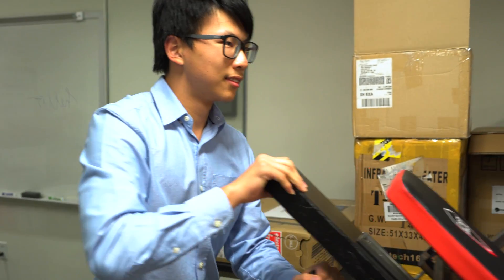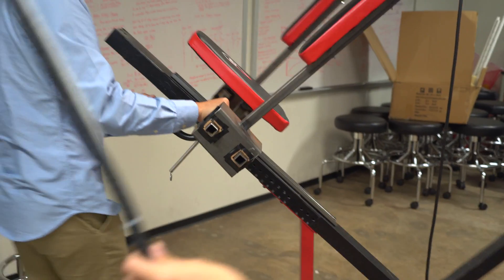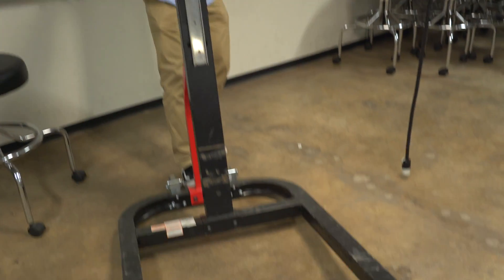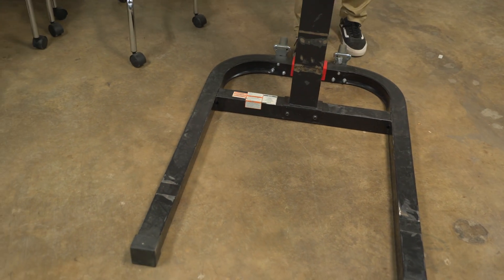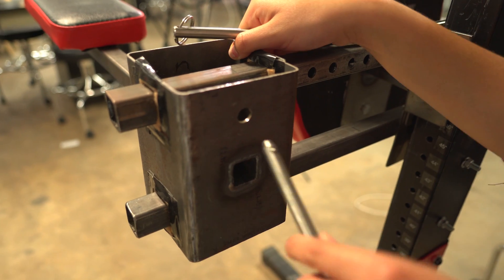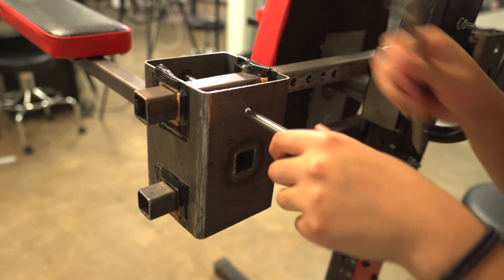Another adjustment we had to make to allow the stand to be usable in the clinic it was made for is we had to add wheels to make it portable, because there are a lot of different rooms in the clinic where our client was, and they wanted to be able to use it in all the rooms that they had.